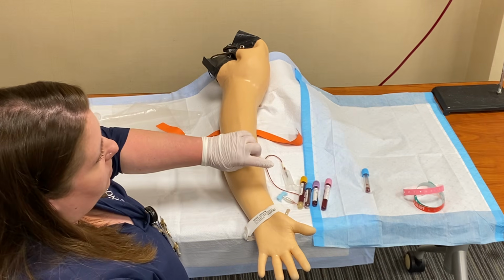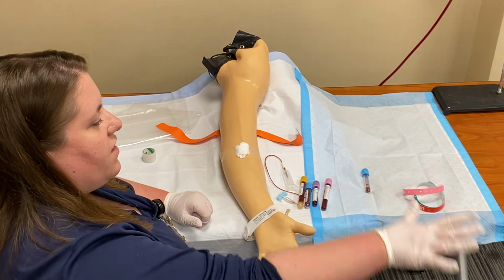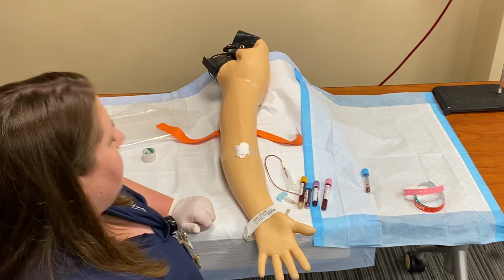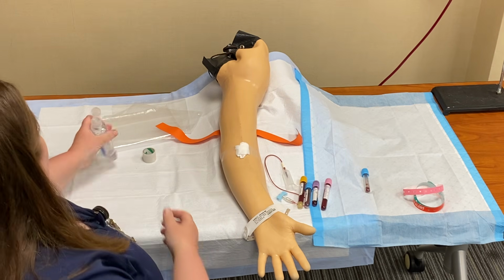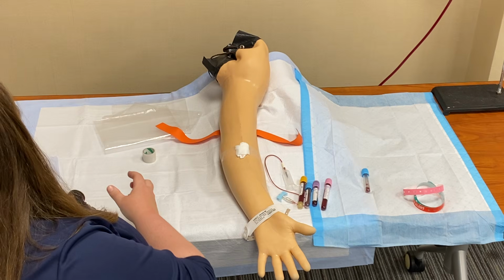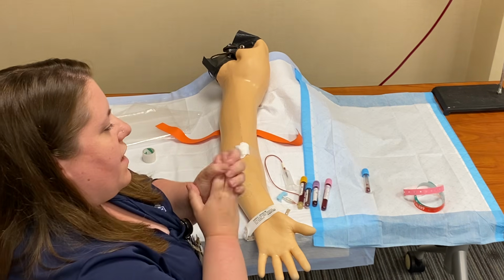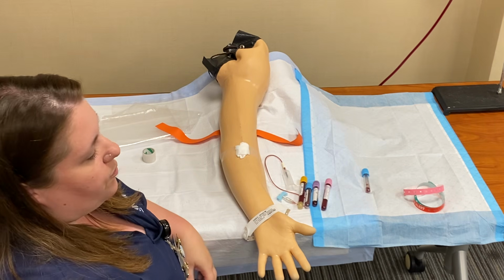If the computer is right next to the sharps container, I can take my sharps with me. If everything is right here in the same area, I can leave everything here, go to the computer. So since I'm going to the computer, I'm gonna remove my gloves and wash my hands. And I've already checked and pulled her screen up. So all I'm doing now is going to be to select the labels that I want to print.